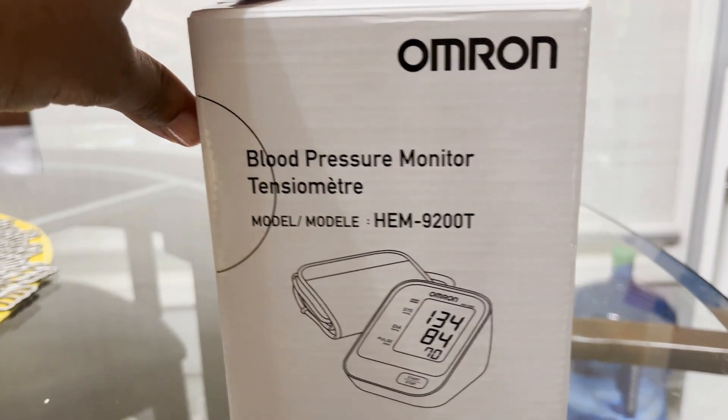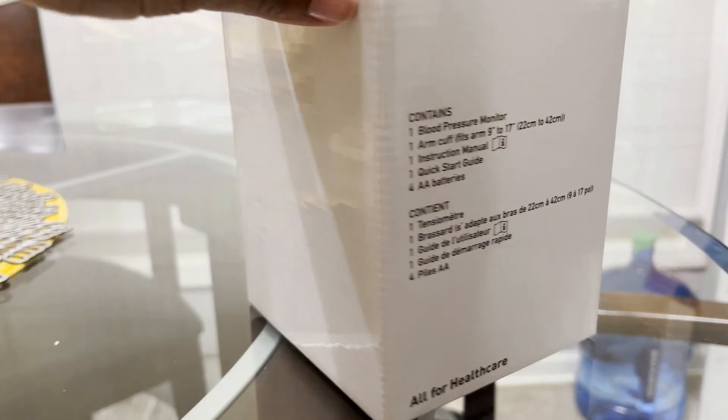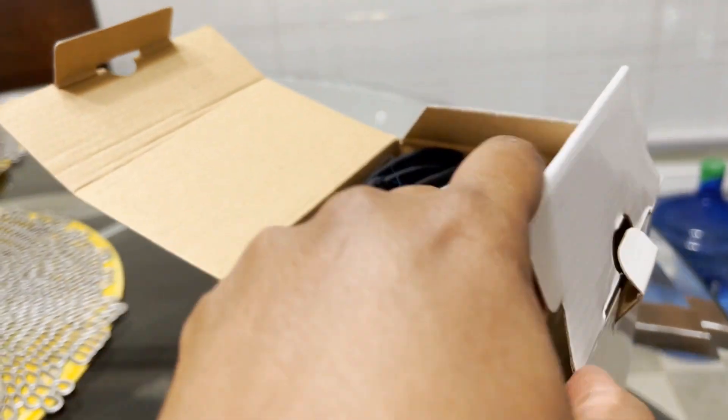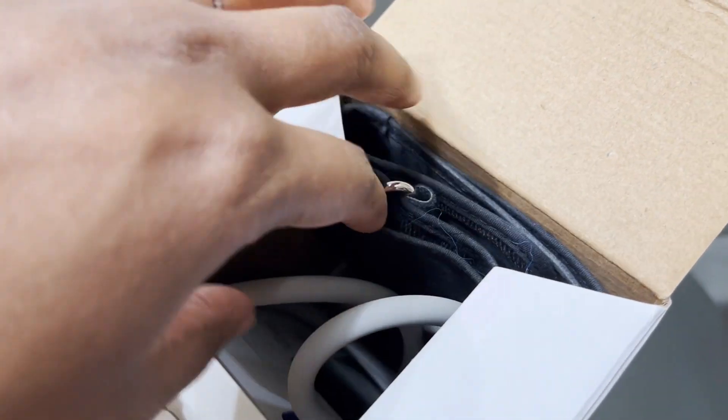Hey there, I want to share with you a home health care essential that's in my home — the Omron Bronze Blood Pressure Monitor. This blood pressure cuff is absolutely amazing. It's digital and it's very easy to use.